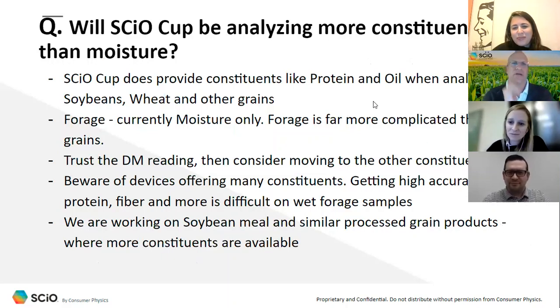Yeah, so I'll take the next couple of slides. These are two questions that came from the audience pre-meeting, and we decided just to generate those answers. The first one was, will SCiO cup be analyzing more constituents than moisture?